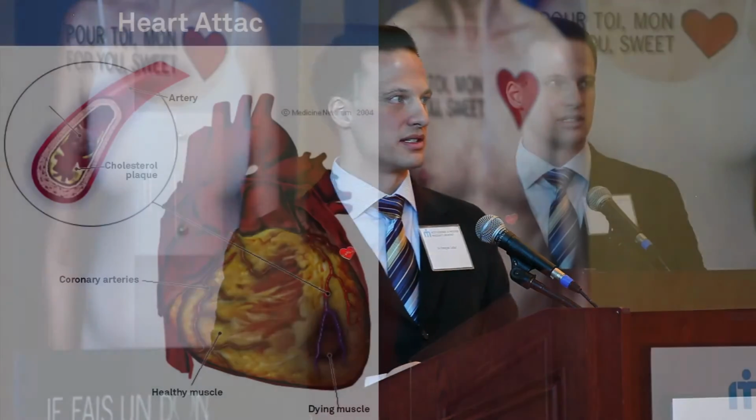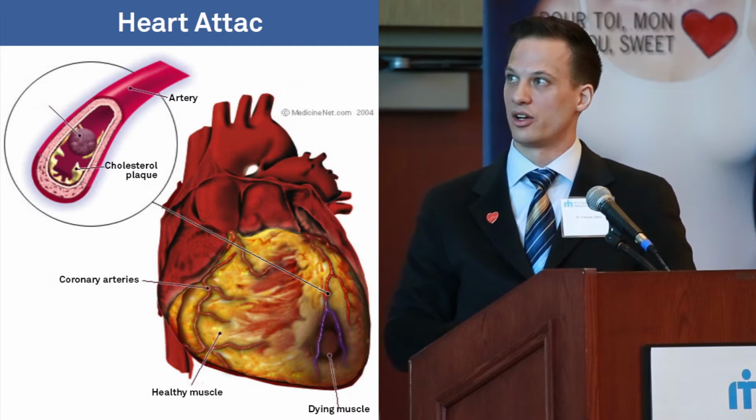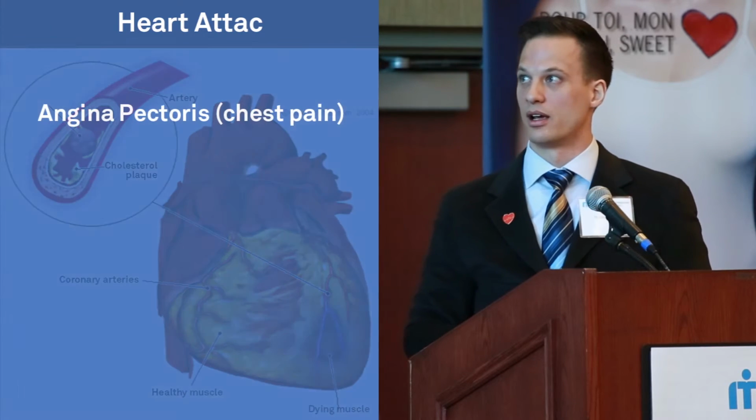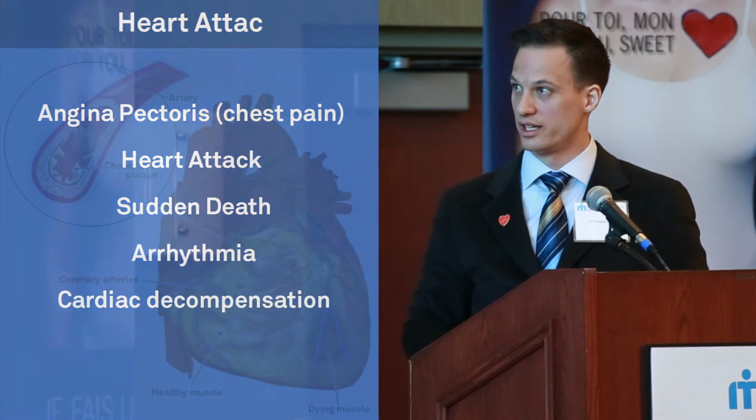Well, it basically ties into what Dr. Chamoun said. We know that coronary artery disease is a top killer, like he said. It's very important, with multiple causes, and can cause serious problems such as chest pain, heart attack, death, irregular heartbeats, cardiac failure, cardiac decompensation, like he mentioned. And coronary artery CT can find these, and can find these very well, almost as good as catheter angiogram.